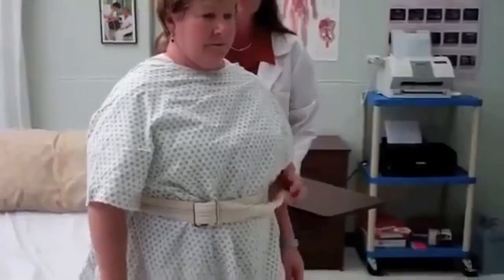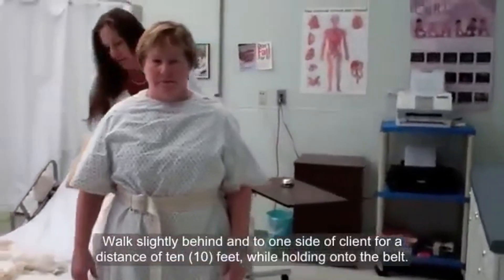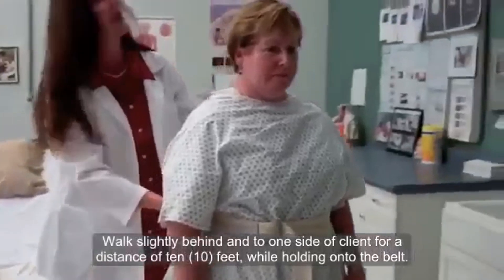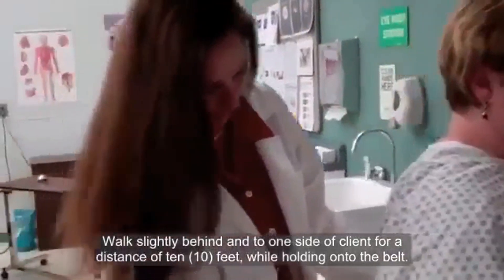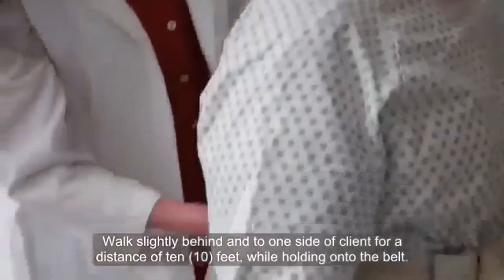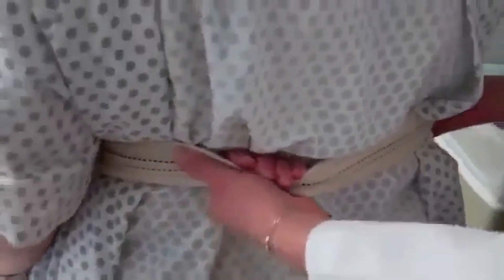Now, we are going to walk over there towards your closet, approximately ten feet. Go ahead. I am right here — actually a little bit to the side of you — but I do have your belt. We can go ahead and turn around, go back towards your bed. You are doing really well. Don't worry about falling because I have my hands under this belt and there is no way you are going to get away from me. I have a good grip on you. Let's go ahead and go back up towards the top of the bed.